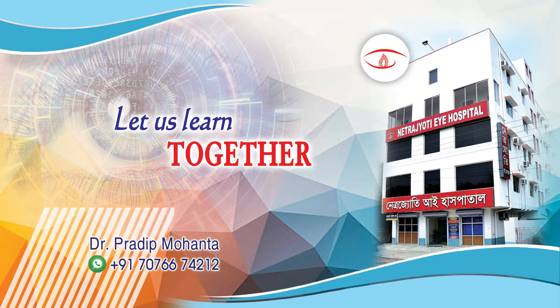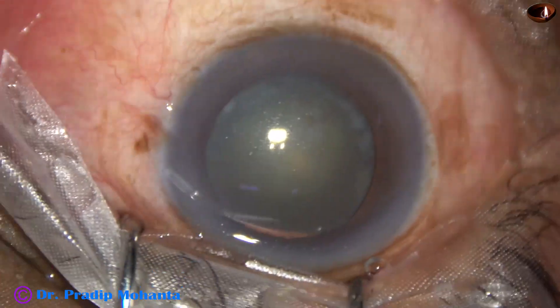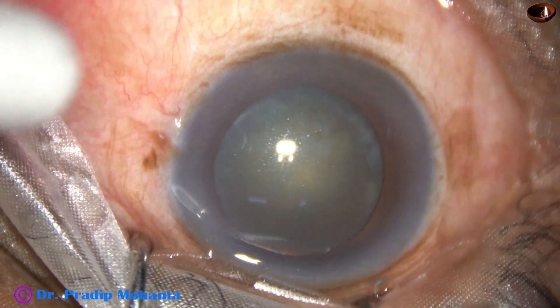In this video we are going to see phacoemulsification of a cataract with grade 3 nucleus sclerosis. The patient is under topical anesthesia.